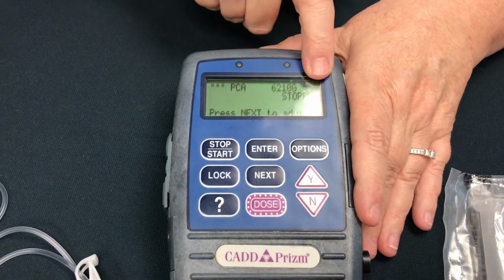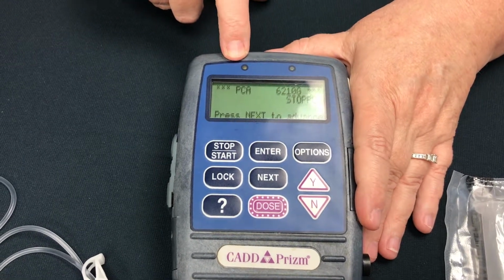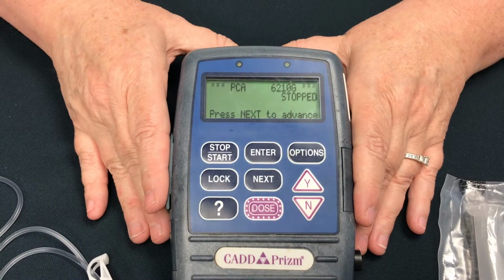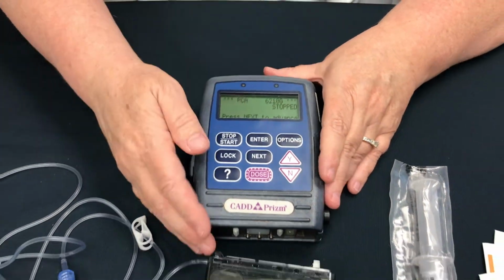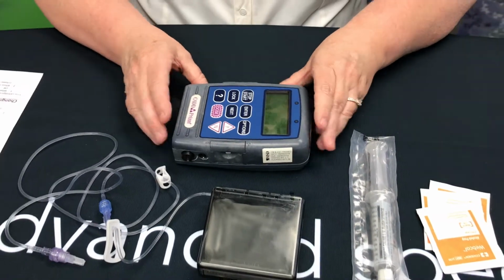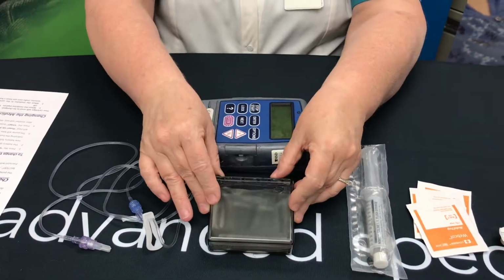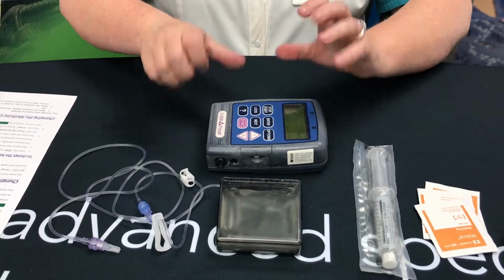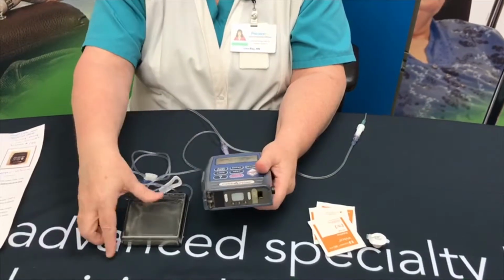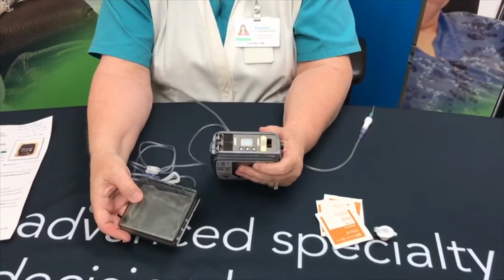You know that it is stopped or not running because this amber light is blinking. So now we are ready to get our pain medicine ready to be changed out. We will need to attach our new cartridge to our pump. Okay, now we're going to attach our new pain cartridge to our backup pump.